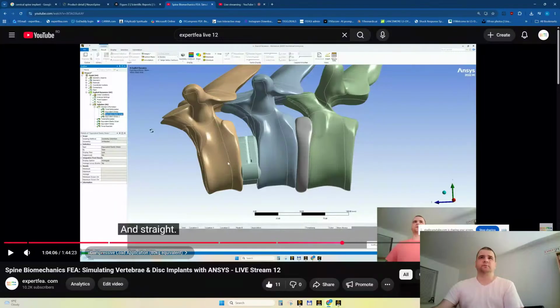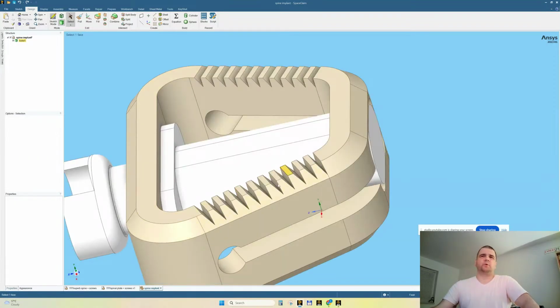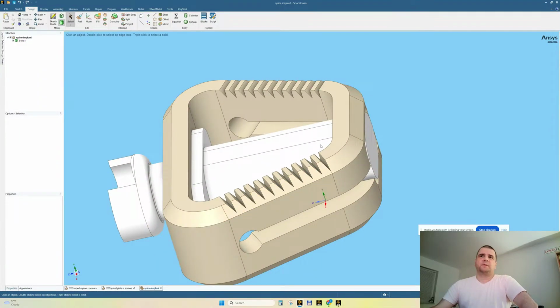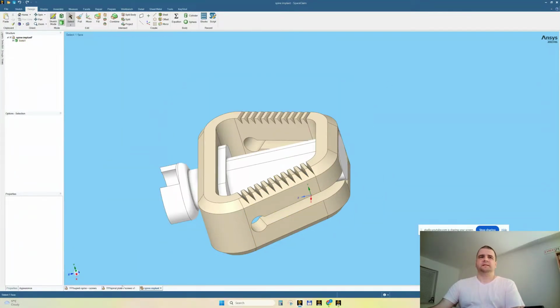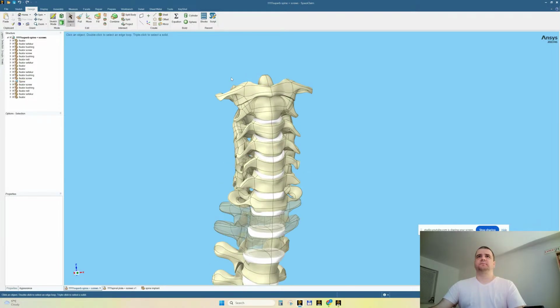If it's not possible, if there will be problems, I foresee lots of problems. I'm talking about the contacts between the screws and the vertebrae. And here some contacts, there will be some problematic contacts here because in the geometry you see here, there are some teeth, let's say, which will cut into the vertebrae, and this will impose problems with the contacts, problems which are harder to solve in static and transient, but they are pretty easy to solve in explicit dynamics, let's say. So without further ado, let's get to the order of business for today.